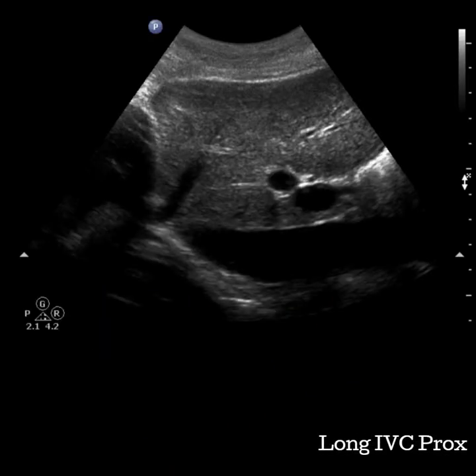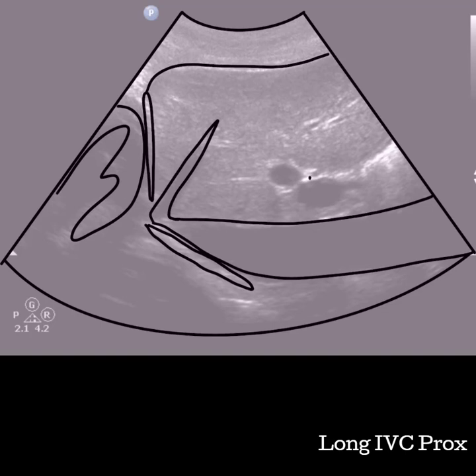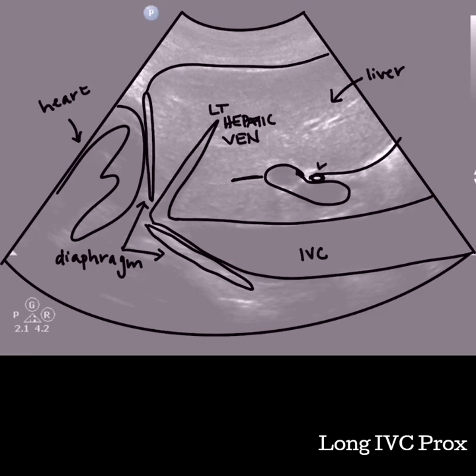The IVC will be in other images and should be evaluated as it is seen. However, in the right upper quadrant protocol, just the proximal portion is necessary. The IVC is typically easier to see than the aorta, because it sits just a little bit more anterior in the body. The IVC sits a little bit more to the patient's right, has variable appearance with breathing, and the walls are not as bright or as thick as the aorta's. You should use these check-off details to make sure that you are on the correct vessel. The vessel should be cleared out using TGCs. Evaluate for any internal contents that may be disrupting flow. The left hepatic vein can be seen connecting to the IVC at the proximal location. The heart and diaphragm are superior in the image, and the liver is anterior. Other structures visible include the portal vein, the hepatic artery in cross-section, and a little sliver of the ligamentum venosum.